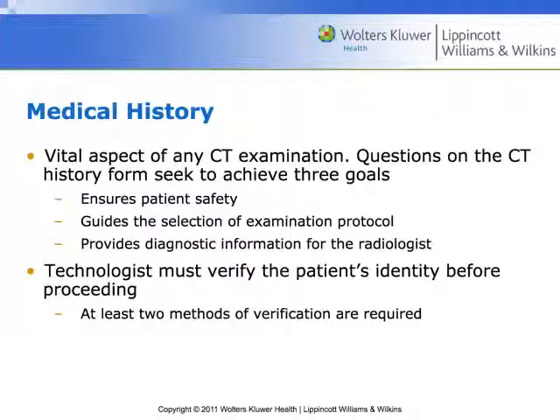Okay, it's really important to get a medical history, and so that's what we'll spend some time mocking today, is how patients give history, how we receive history, and how best to ensure patient safety. We'll be talking about this even more when we get into contrast next week, okay? Different ways that we have to make sure we're safely doing the procedure that we're doing, right?